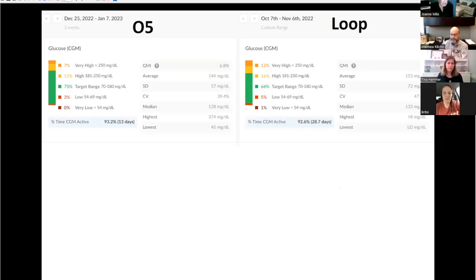For me, it's more about the results than what you did to get there. I don't care what the target was actually set to, but those are the results that matter to me. I thought the same thing going back to the Tandem closed loop solution.